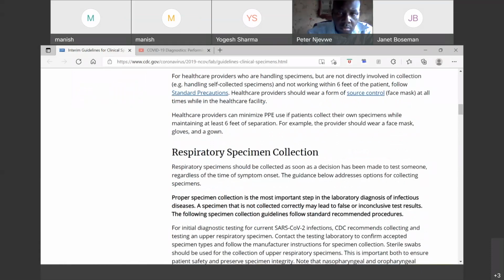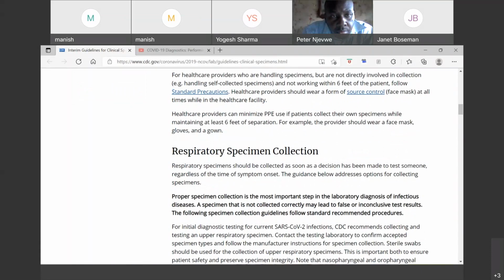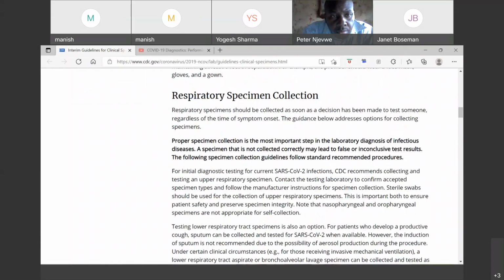Respiratory specimen collection. A respiratory specimen should be collected as soon as a decision has been made to test someone, regardless of the time of symptom onset. The guidance below addresses options for collecting specimens. So as soon as we get information that we have to take a swab from someone, we do it.